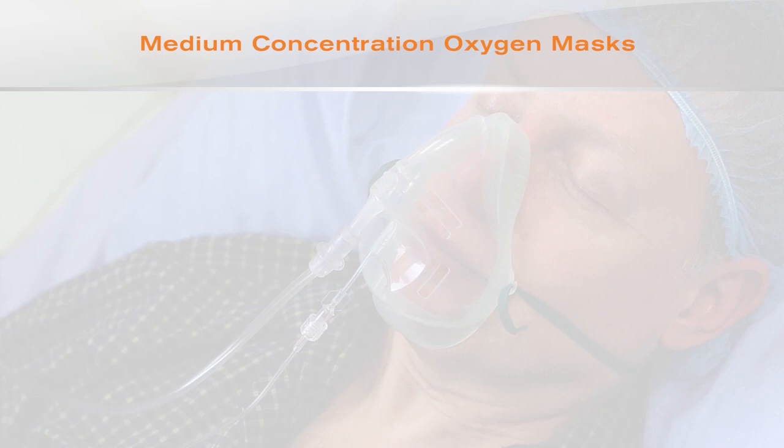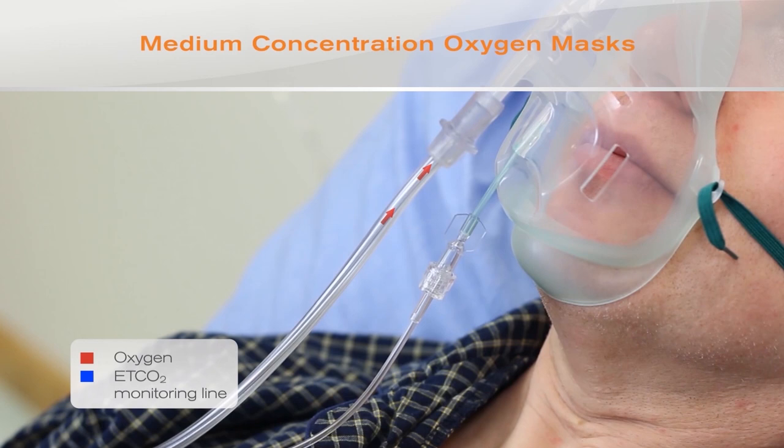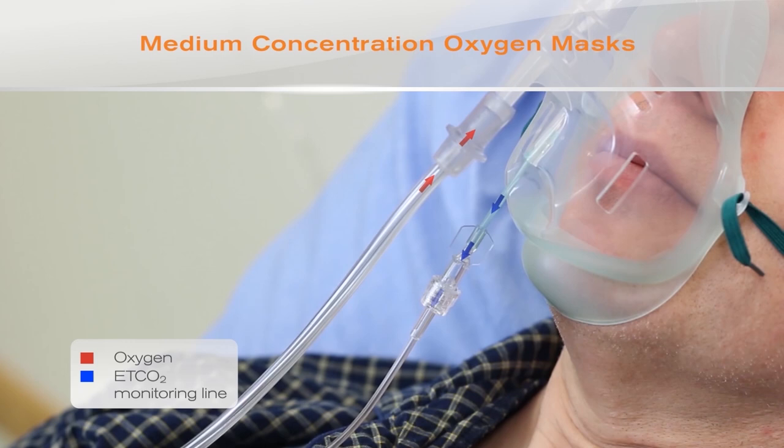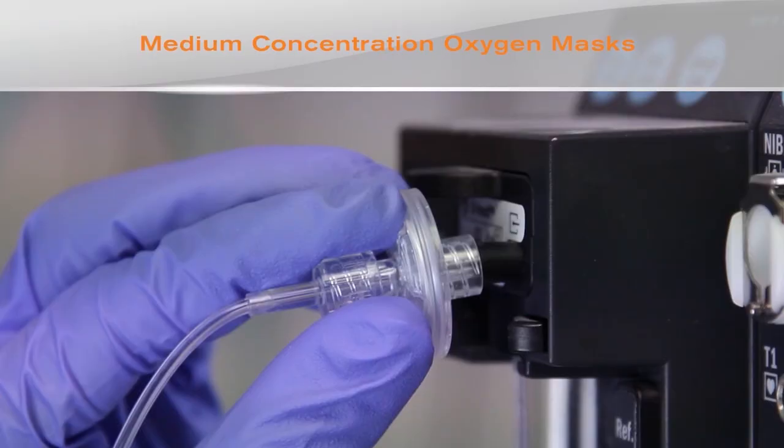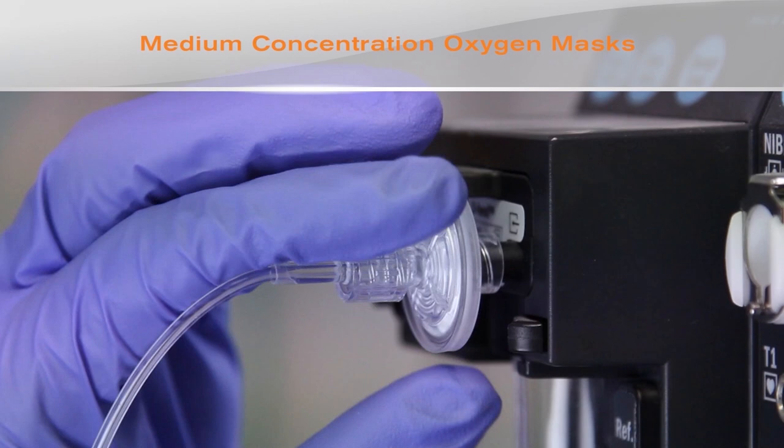Medium concentration masks, such as the Intersurgical Sentry mask, are also available with the ability to measure end-tidal CO2. This is beneficial for patients undergoing conscious sedation where respiratory depression should be monitored. A monitoring line can be attached to the mask with a Luiloc connector, with the other end attached to a capnograph.